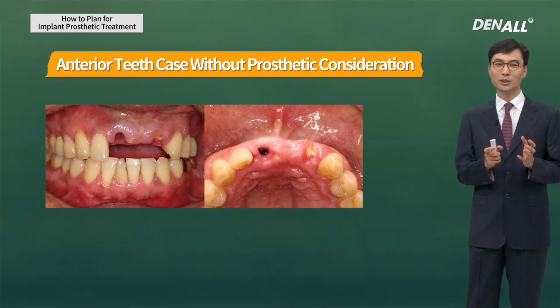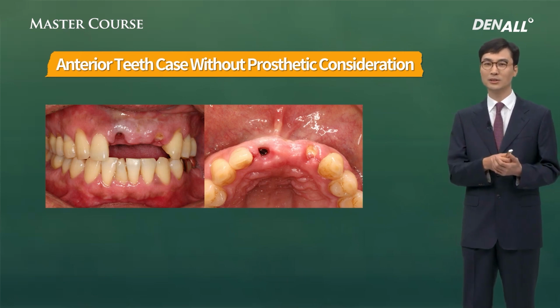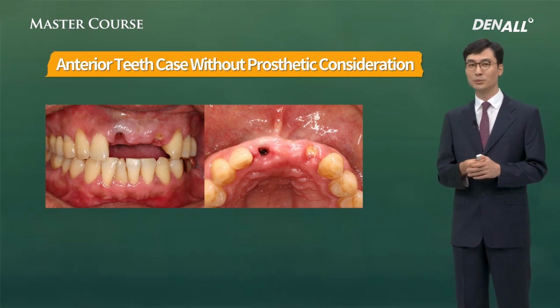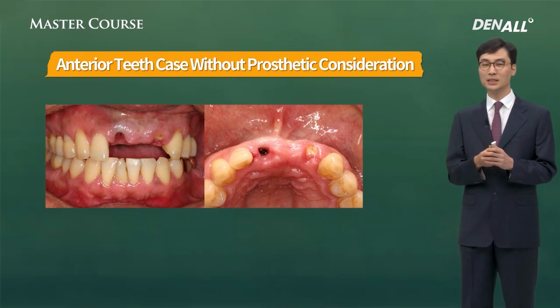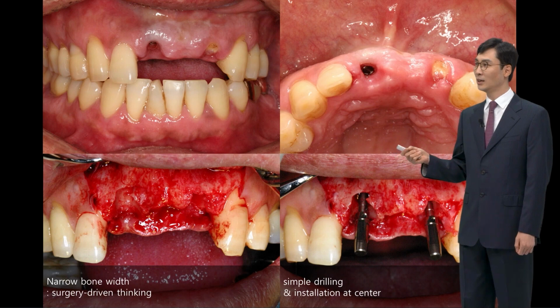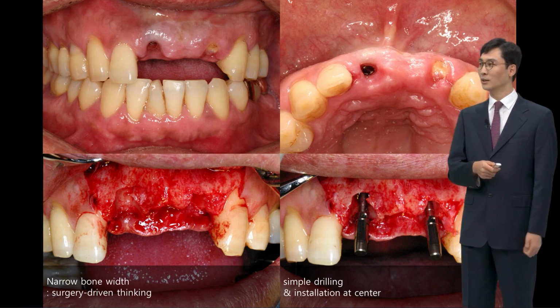With the final prosthesis in mind, you need to proceed with implant surgery. At times, this may not be possible. I want to show you my case. It's quite embarrassing. I did it approximately 15 years ago without any such preparations, and it was a disaster. The patient was middle-aged. Due to injury, the bridge using natural tooth was fractured, and the patient came and emergent surgery was performed.